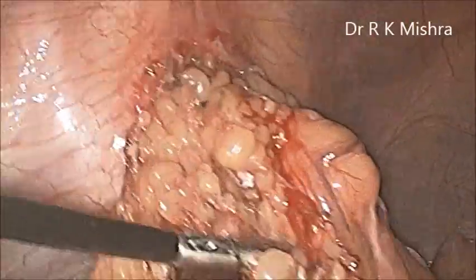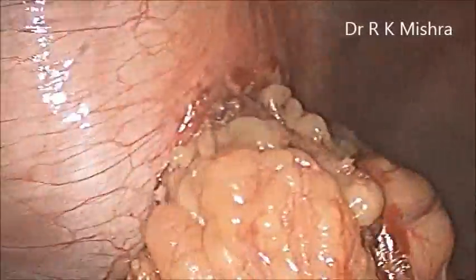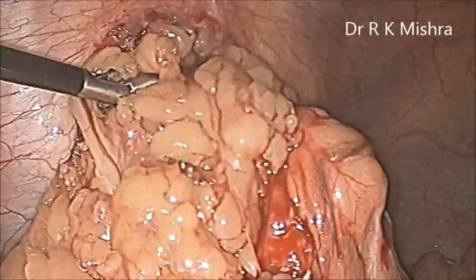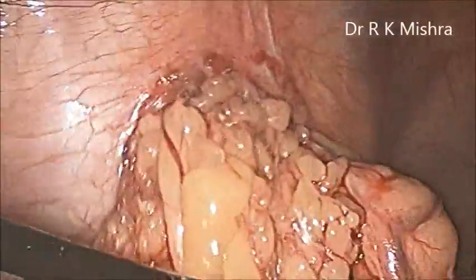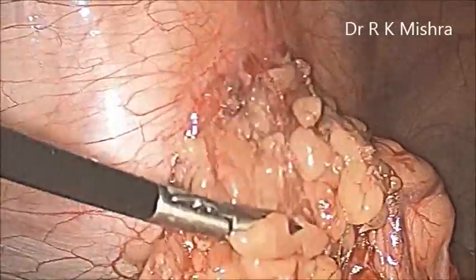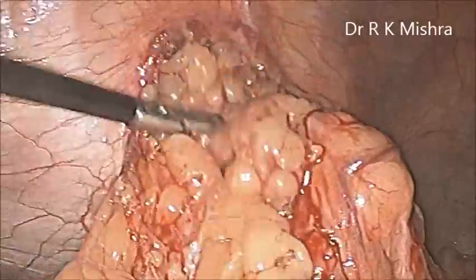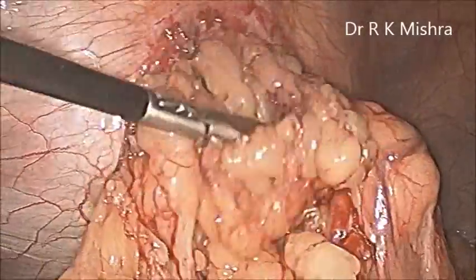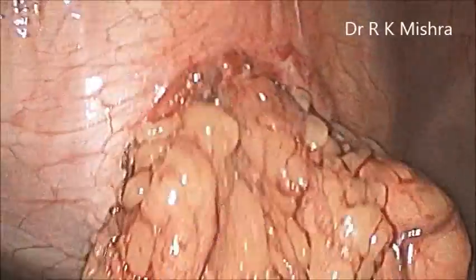If you do aggressive resection, a huge amount of omentum can come out, and that way you can reduce whatever you want. You can feel the ring of the defect by putting the finger from above, and that way the amount of content you can decide. Here slowly we can see it is almost done. Now you can use the harmonic again to do further additional isolation.